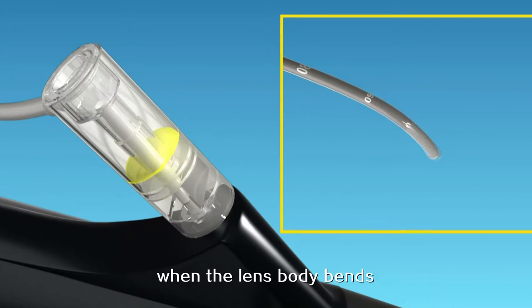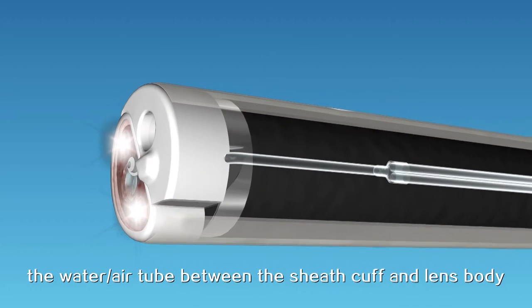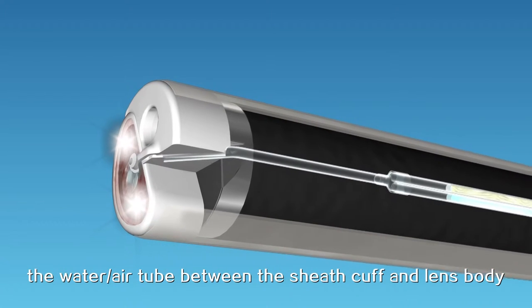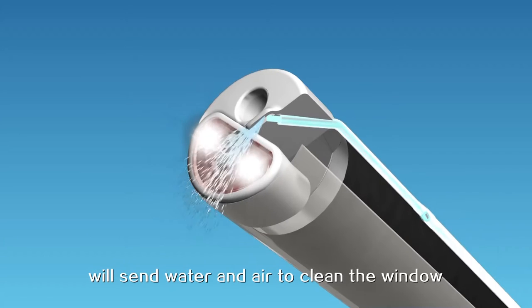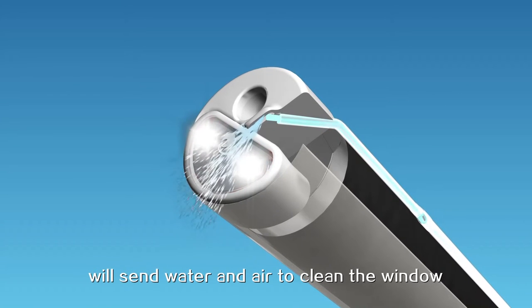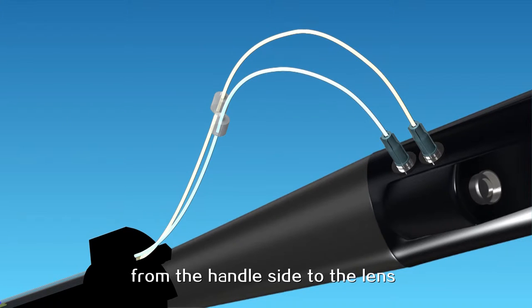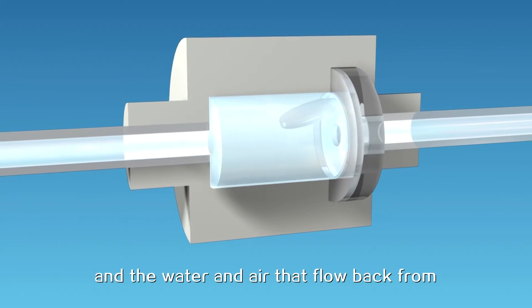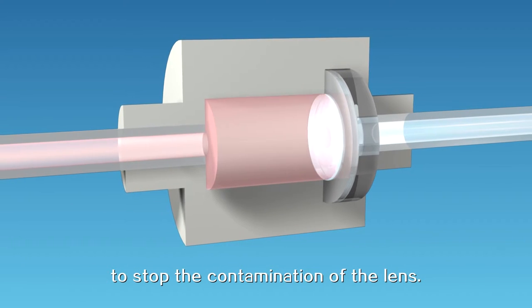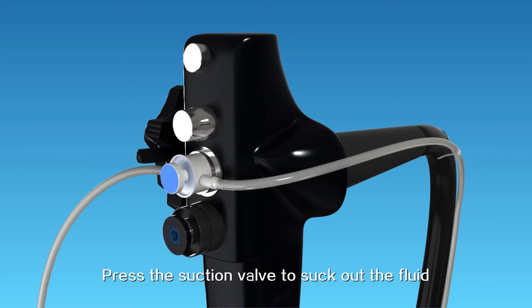There is a movable sealing ring and a three-way sealing cap to prevent leakage due to movement of the biopsy channel tube when the lens body bends. When the window is dirty, the water-air tube between the sheath cuff and lens body will send water and air to clean the window. The water and air can only flow from the handle side to the lens, and water and air that flow back from the lens will be blocked by the one-way valve to stop contamination of the lens.